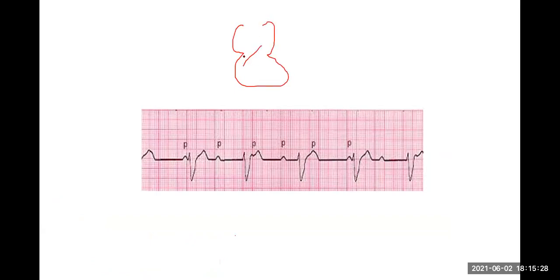Since none of them go, the ventricle starts generating its own rhythm. That is called an escape ventricular rhythm. Escape.